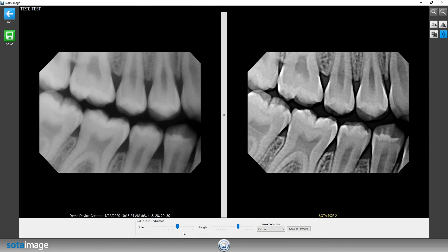Most of the time I've seen offices have very good images come out at about 4 to 5 over on the effect, and about 9 to 11 over on the strength.